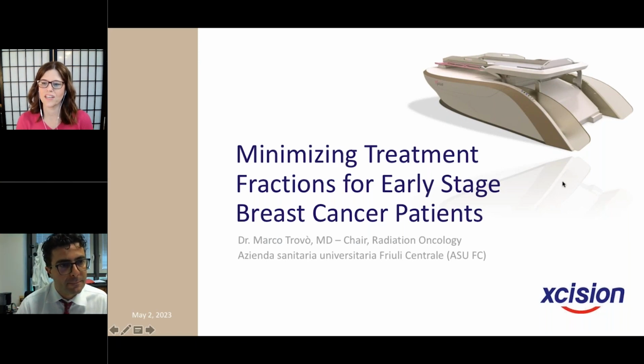Okay, thank you. That actually is a good segue to the next question. You mentioned there are 150 patients. Is that across all 3 patient groups with the pre-op, post-op, and the boost, the APBI, SBRT? The person's question is related specifically to, since the installation, how many patients total have been treated in each of those groups? Was it more patients than in your trials that you presented? We treated almost 80 patients in the postoperative single fraction radiotherapy, PBI. 44 patients underwent preoperative radiosurgery to the tumor in situ, and almost 26 patients received one single fraction as a boost, followed by whole breast radiotherapy.